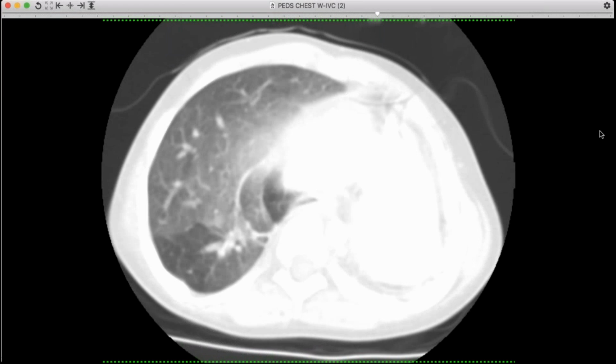Unfortunately, I don't, because I came across it and I don't remember. I don't know if I saved it or not, but it looks like one lung. I'll see if I can find it again. It's one of these ones I grabbed quickly on the fly. I was like, oh, I might use it for something. I may have actually shown his case before. I don't remember his childhood case.